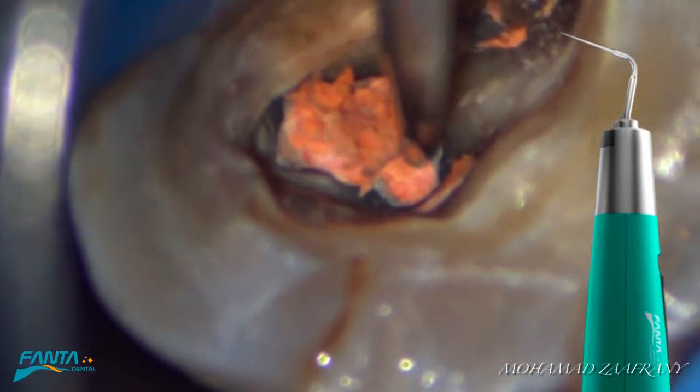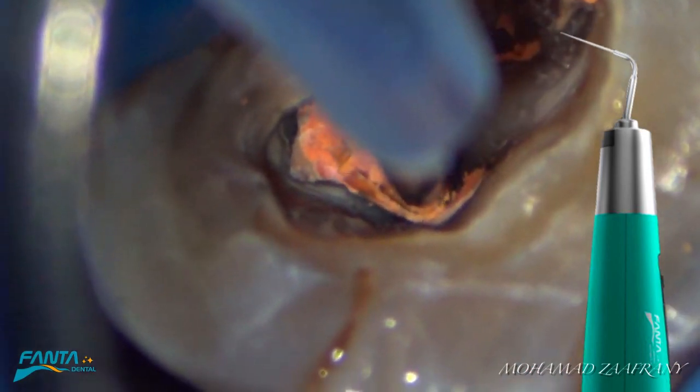Another case demonstrates softening coronal gutta-percha for easy removal.